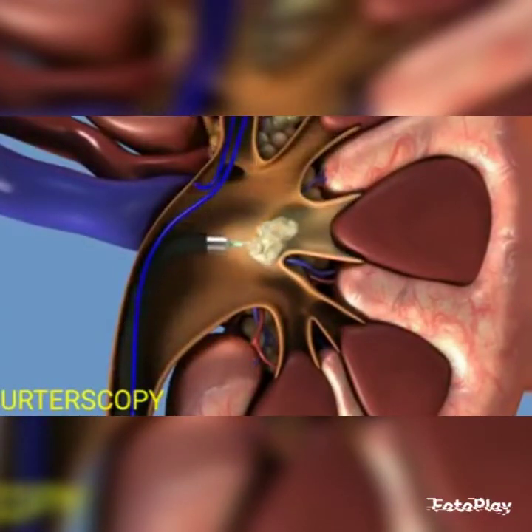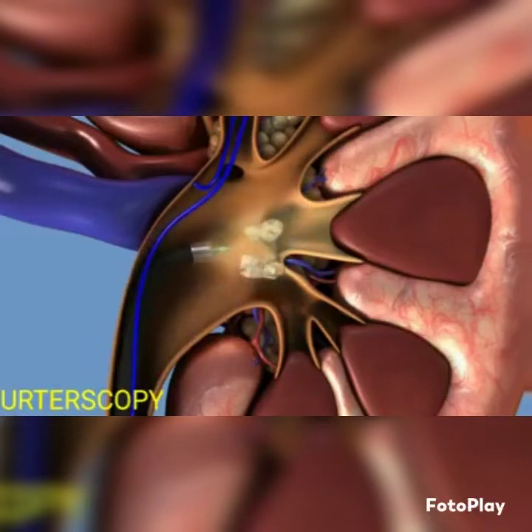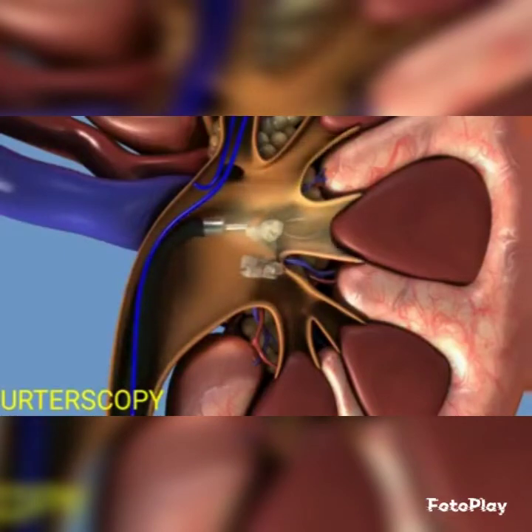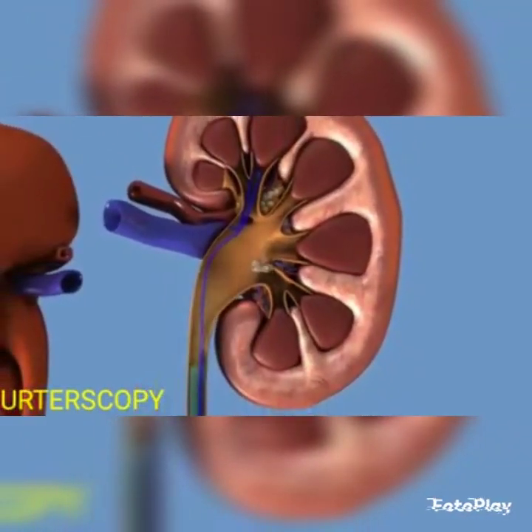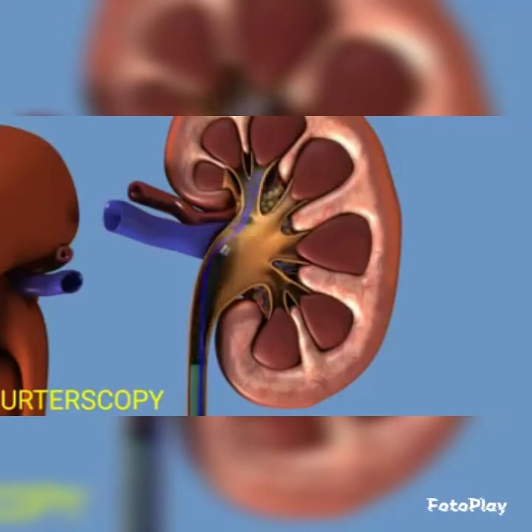Once the stone is located, it may be pulled out directly with a so-called stone basket, or a laser is used to break the stone into smaller pieces before extraction using the basket. After stone extraction, the collecting system is checked to ensure that no residual stones have been missed.